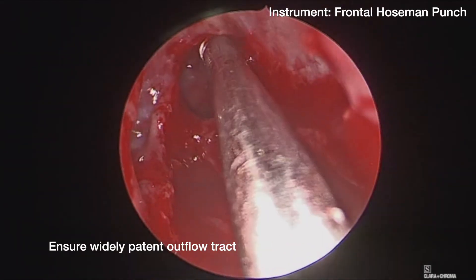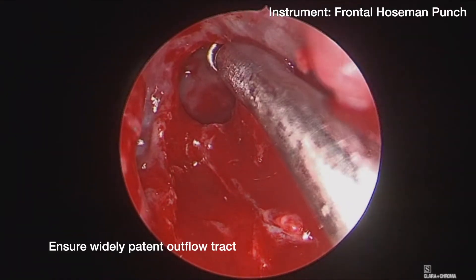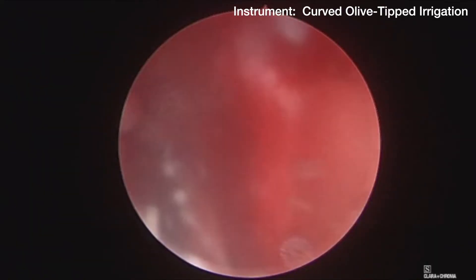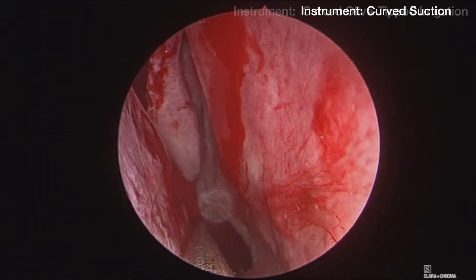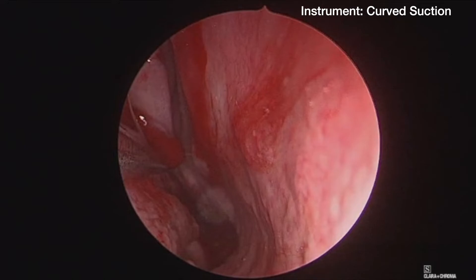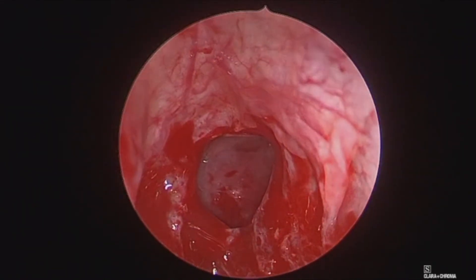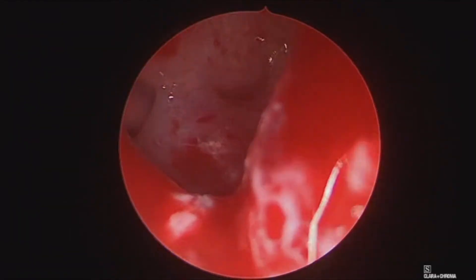Finally, the outflow tract is expanded with a Hoseman punch to ensure that it is widely patent, and additional irrigations may be performed as needed. Here you see suctioning of the nasopharynx with all of the irrigation and a bit of fungus as well. Here is a final view of the frontal sinus and outflow tract.